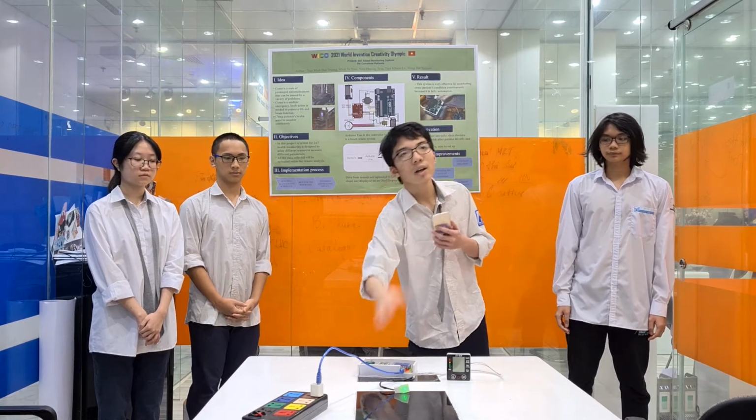After handling input signals from the sensors, the Arduino sends the output, which is the patient's parameters, to 2 locations. The first location is an OLED display, which will directly provide doctors or nurses with medical data from the patients. The second location is a website known as ThingSpeak. The Arduino Uno board sends data to the ThingSpeak server via Wi-Fi, thanks to UART communication with the ESP8266 module.